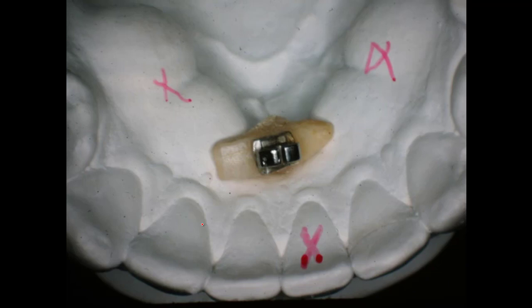Okay, let's see. Now there's the tooth. Now on a lady like this, you see, we put the bracket on this tooth out here, and we ground it down a little bit and got it about that wide, you see. And then we pull it out and work pretty good and get that together. And we took these tori out after that. So you can grind that tooth down to keep from showing this crack any longer than you have to, and pull this together, you see. And now you reduce this tooth in dimension and get these teeth right over here by that.